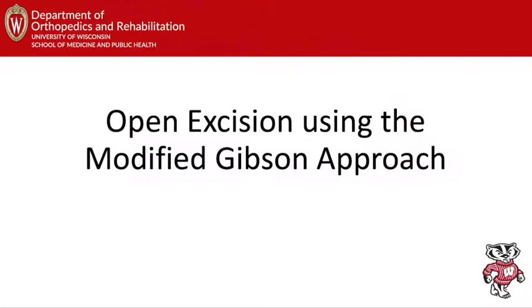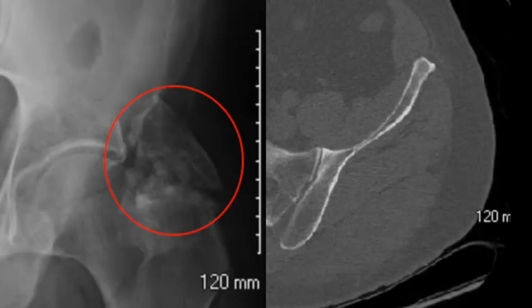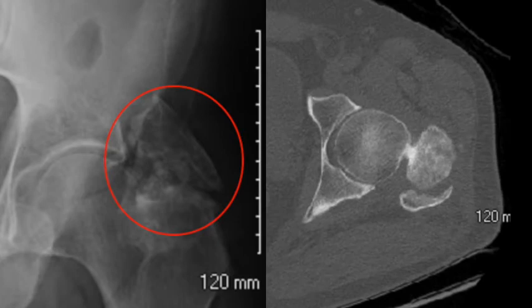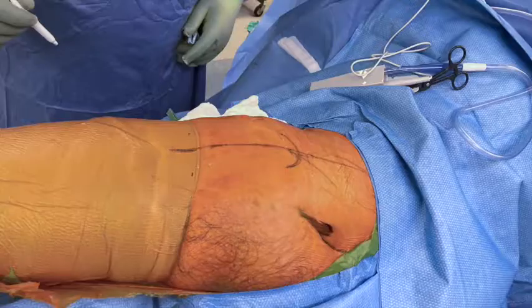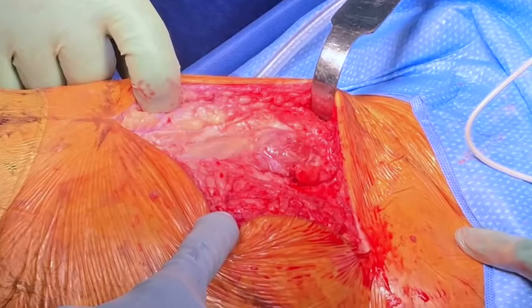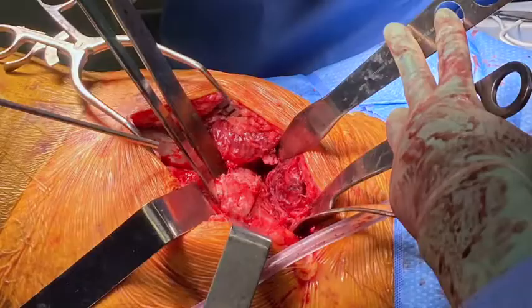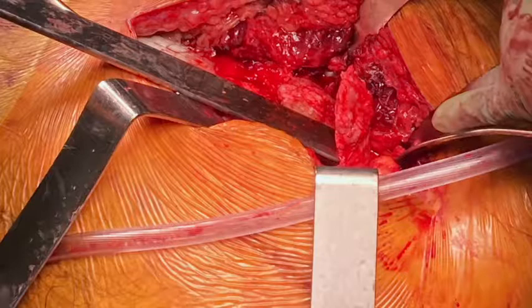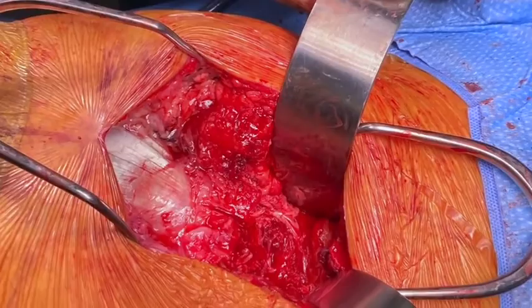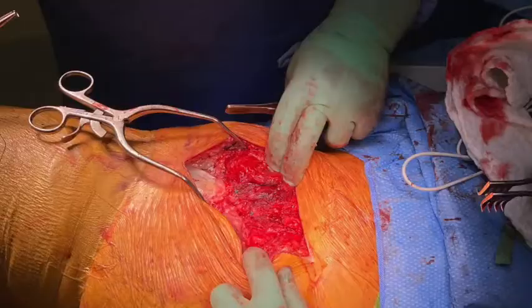Here we discuss one approach to open HO excision. This patient had significant HO outside of the hip joint from a prior intramedullary nail, and also had concomitant labral tear and FAI, so hip arthroscopy was performed first, with portals modified slightly to avoid encountering the extra-articular HO. After completion of labral repair and CAM decompression with capsule closure, the patient was repositioned in the lateral position and a modified Gibson approach was used. The HO was carefully dissected with osteotomes from the distal abductor insertion, and the abductors were subsequently repaired back to the greater trochanter.